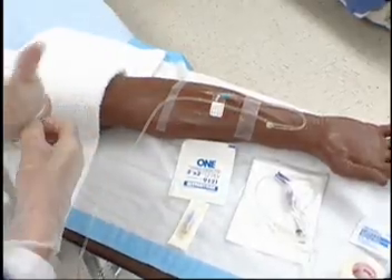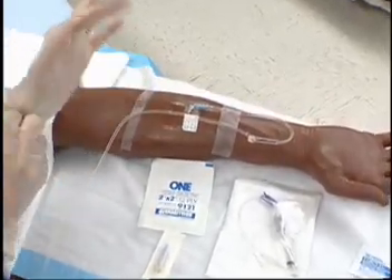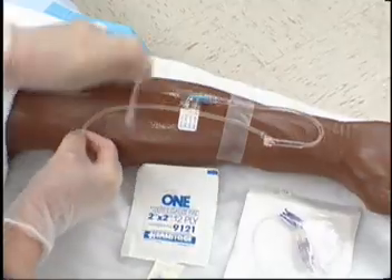Assess that the IV is infusing and the IV site has no signs of phlebitis or infiltration. Clamp infusion tubing.